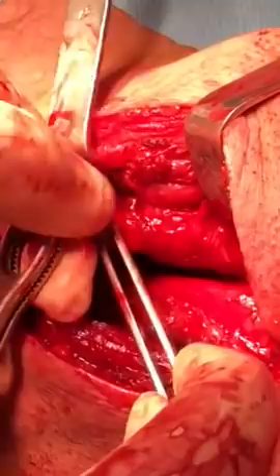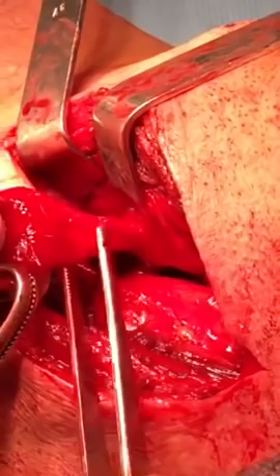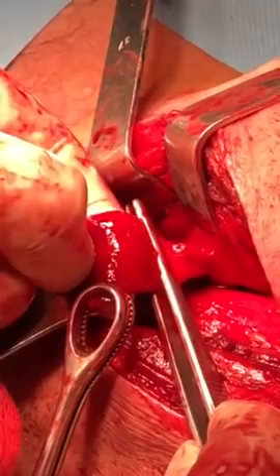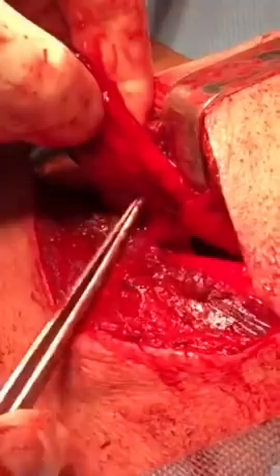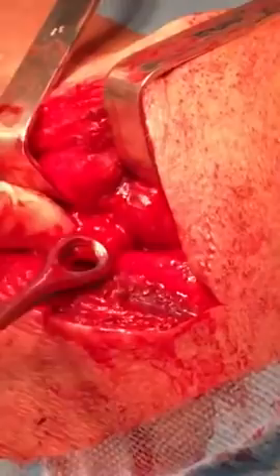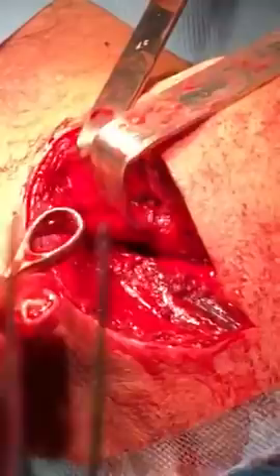This is the correct level of transection to avoid narrowing of the esophagus. We will transect this mucosa after total release using a stapler. We cannot transect it too far down because this will cause stenosis. Here again is the release, and here is the neck of the pouch.